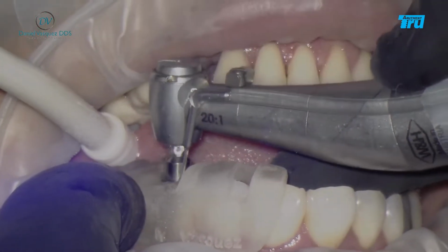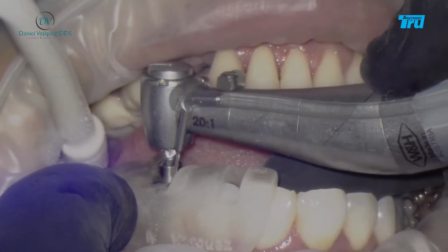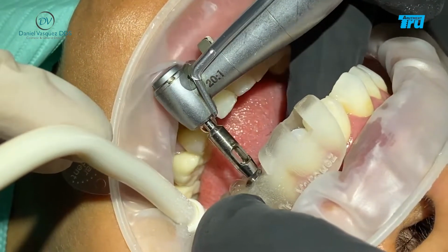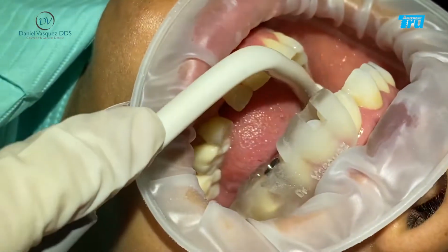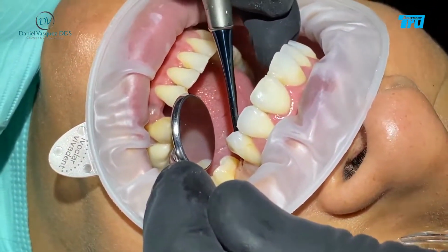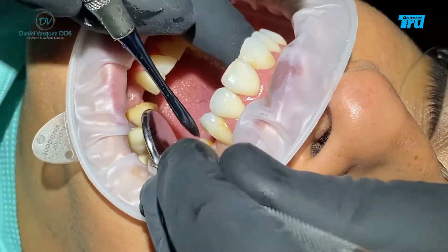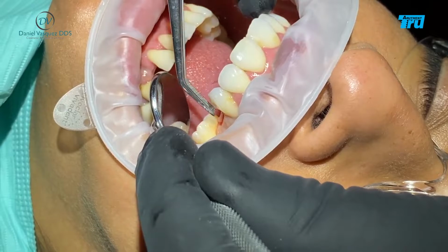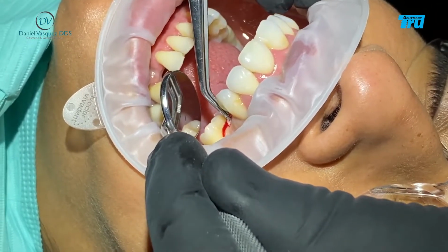So first we're going to go tissue punch until we hit the bone. Are you done with that one? Remove this little tissue that we have here. Beautiful. Excellent.